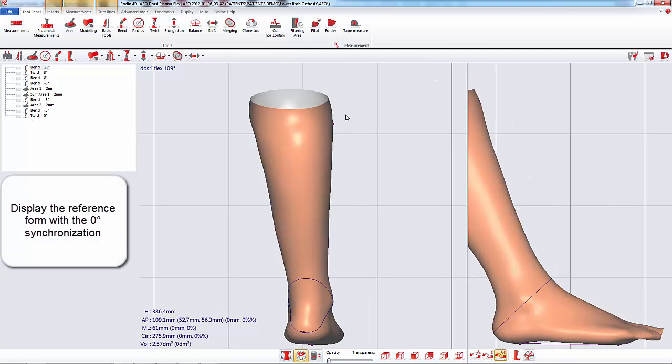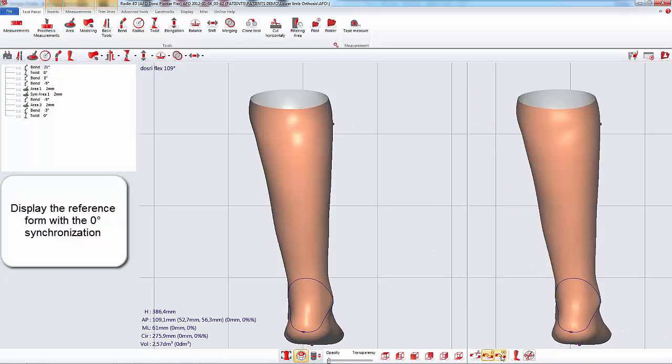The 0 degree synchronization allows you to see the reference form in the same positioning as your form.